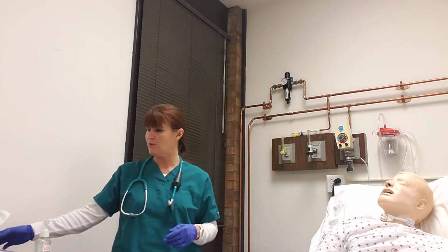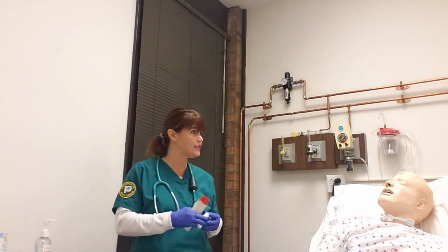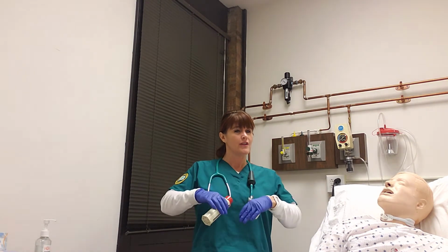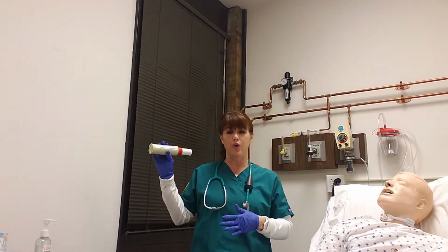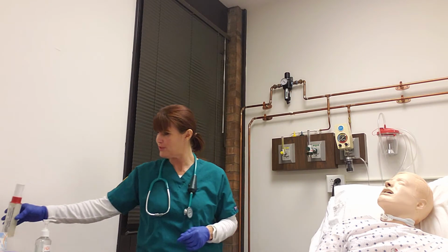Okay, the next thing I want to do is we're going to check your peak flow. Do you remember how to do that? Take in a nice breath and then forcefully exhale. Just give me one good one. Okay, I'm going to put this spacer on. You just wrap your lips around that. Again. Okay, please do that. All right, thank you. Pretty good.